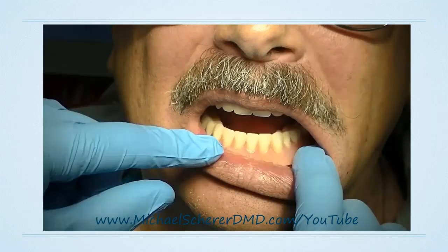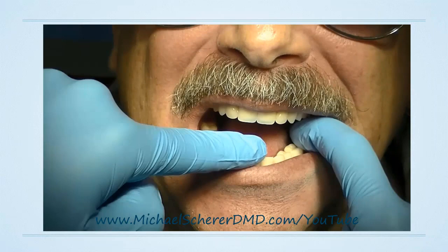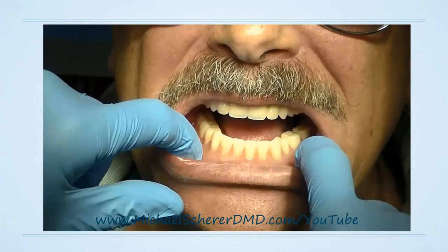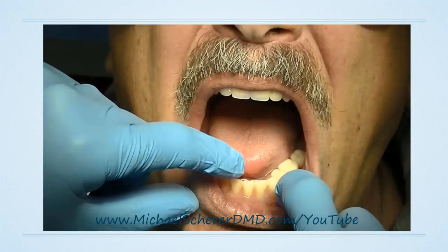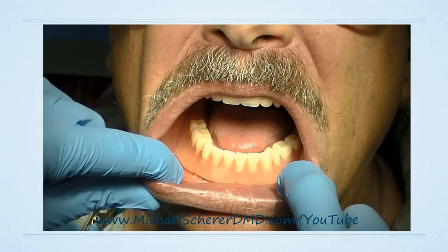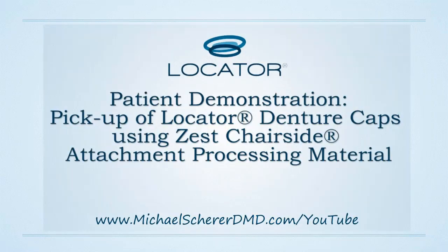Even though the locator abutment is meant to pivot somewhat, the vast majority of the time, even with a 2-implant overdenture, there's not a lot of movement of your patient's denture. If the procedure is done properly, if the denture is done well, this is what it should look like. There shouldn't be a lot of movement of the denture when the patient sticks out their tongue, smiles really big, or bites down on one side.